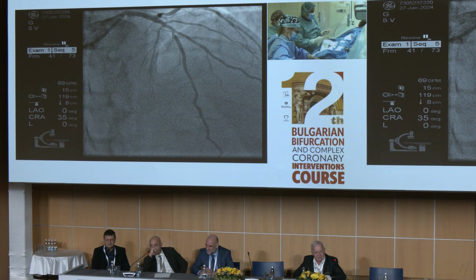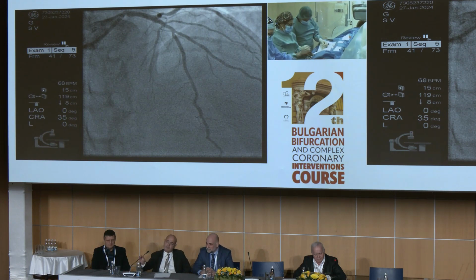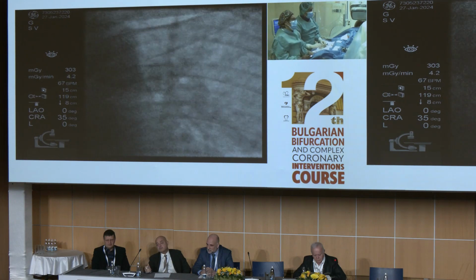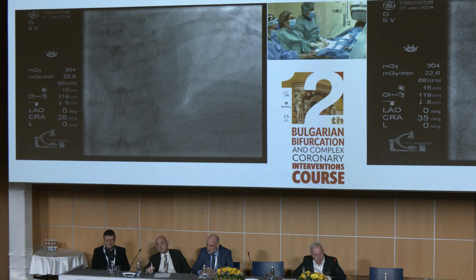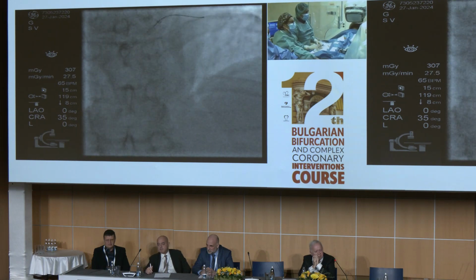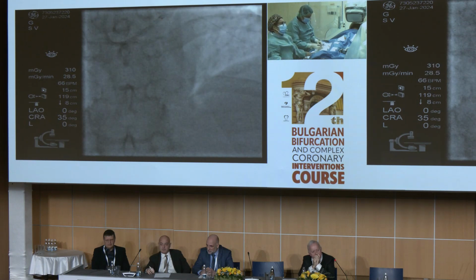So that was one of the questions yesterday. Absolutely, it's the right strategy to guide the revascularization, the completeness of revascularization in this patient after STEMI, by physiology assessment. And actually there is strong evidence about that. But we felt so confident that the lesion would be significant that we thought it would be more useful to guide the intervention with an IVUS system.